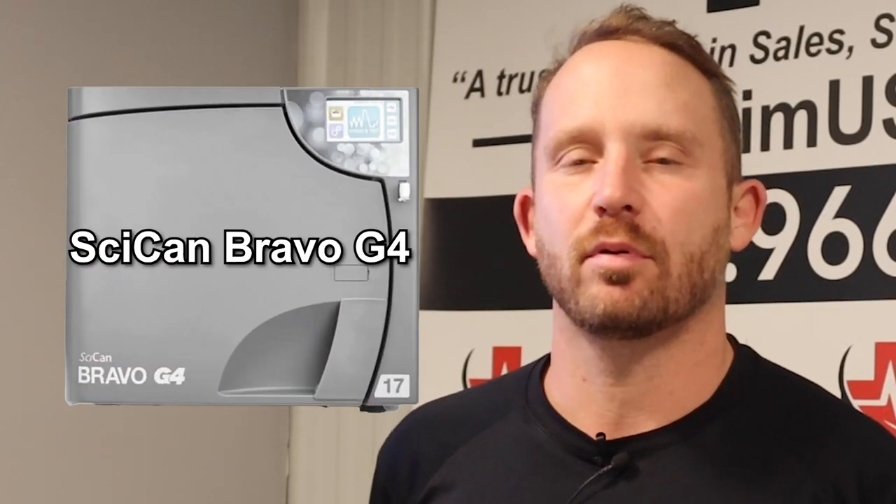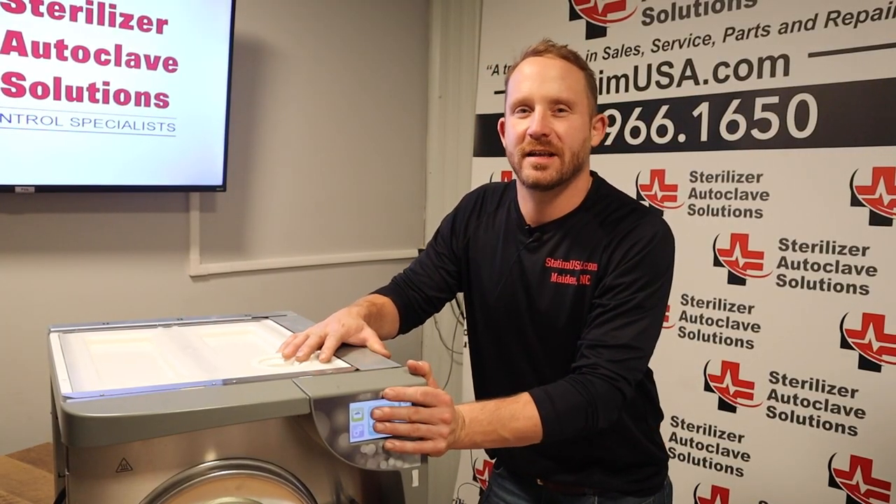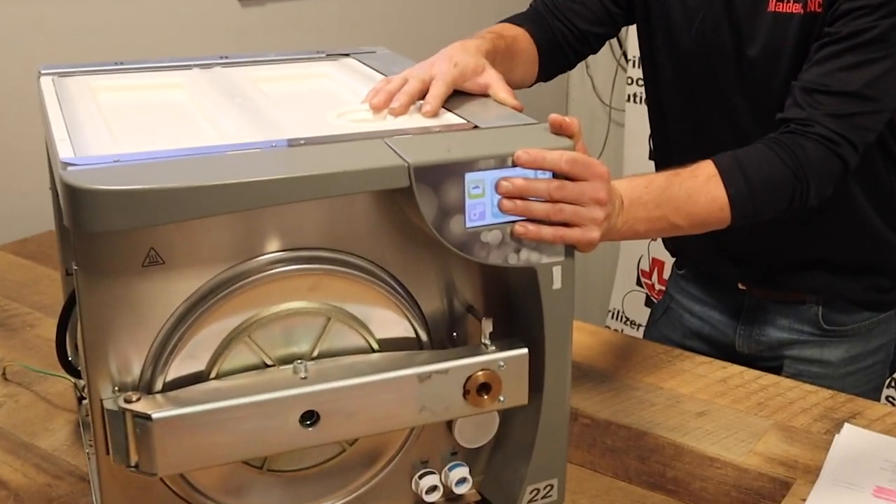Hey there, Andrew here with Sterilizer Autoclave Solutions. Right now, we're going to go through the error codes on the SICAN Bravo G4. And with us, we have our test dummy, SICAN Bravo G4.